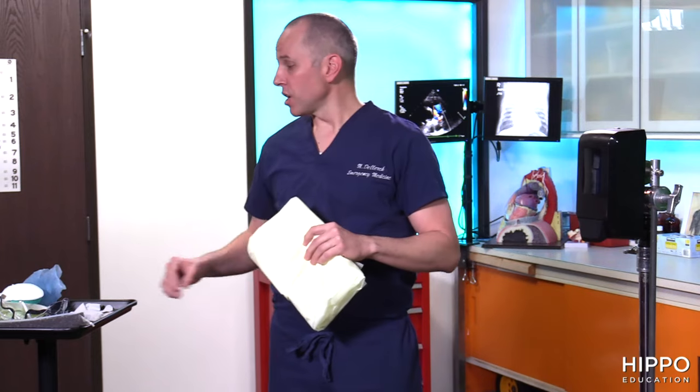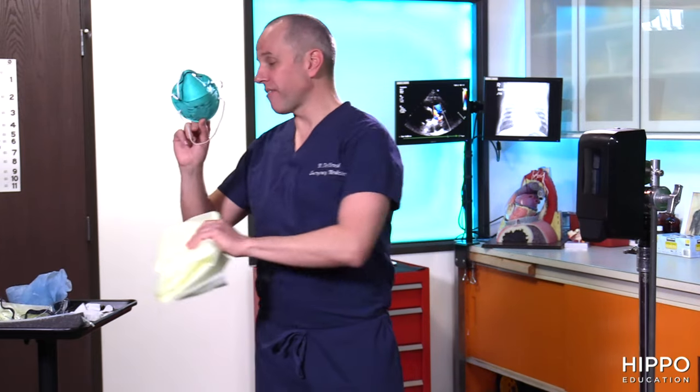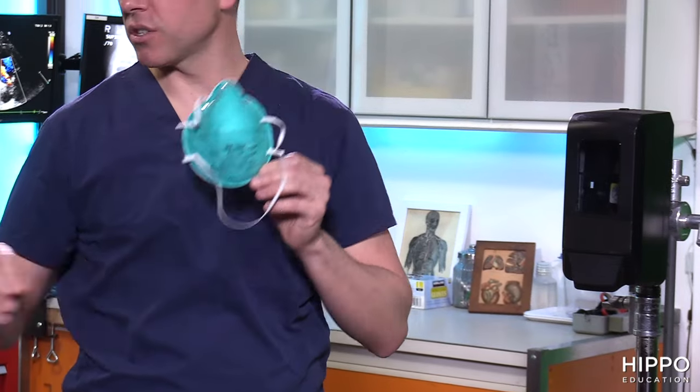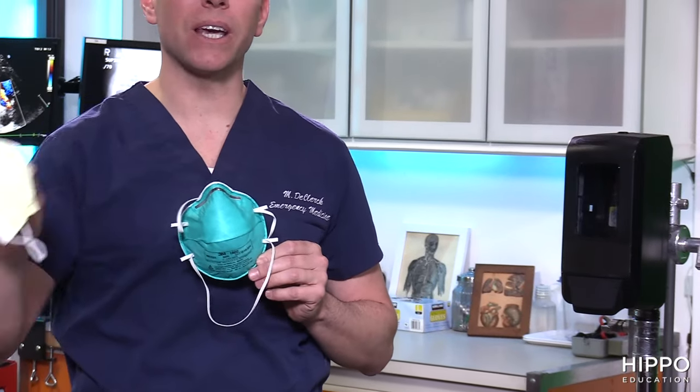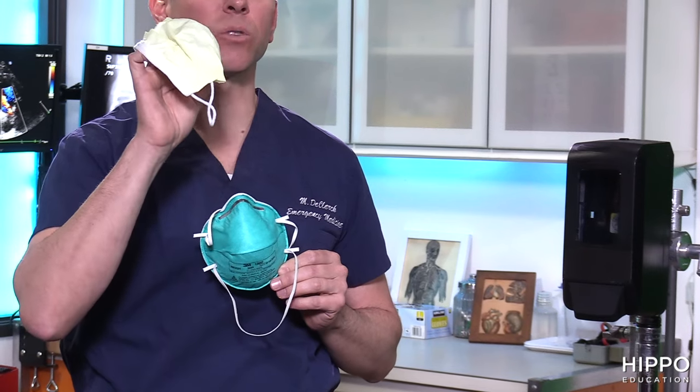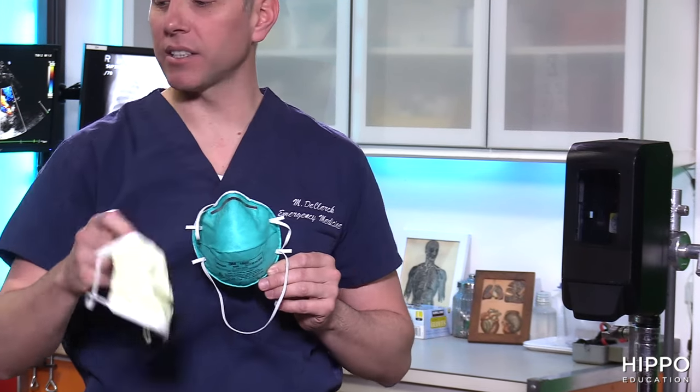Before we get into those procedures, let's talk the basics — what equipment are you going to need to protect yourself properly? The first thing is going to be a gown. You'll also need an N95 face mask for airborne precautions. If you don't have one, you can use a surgical mask, but that will only be for droplet and contact precautions.